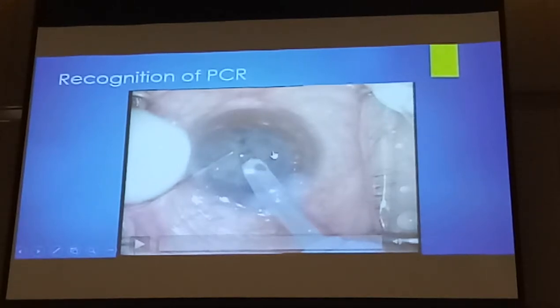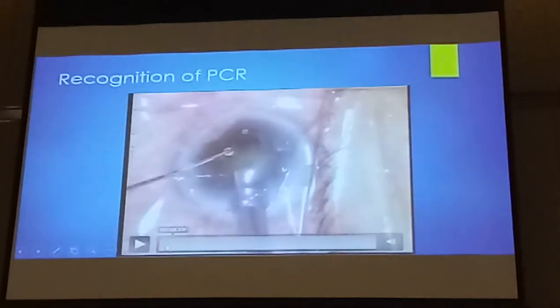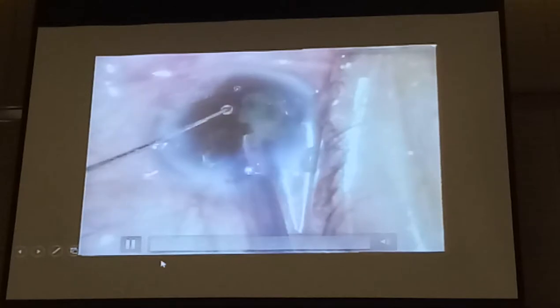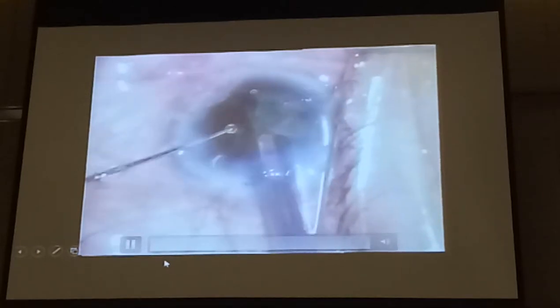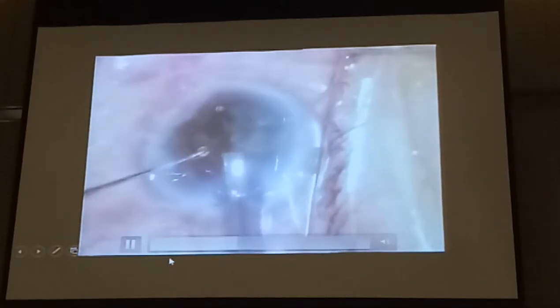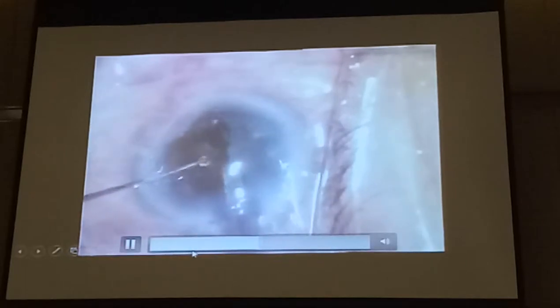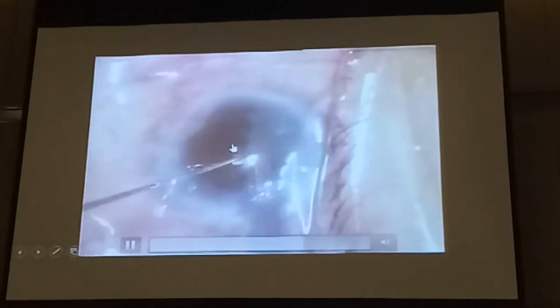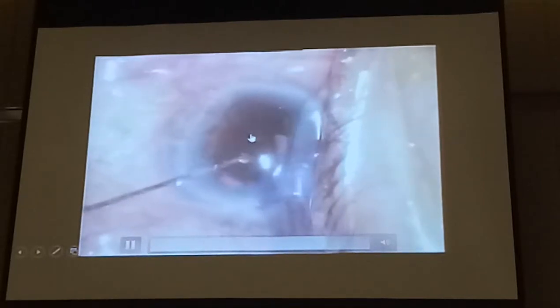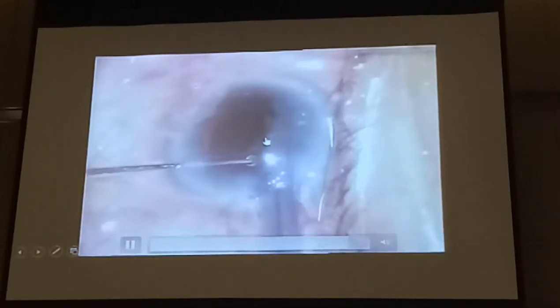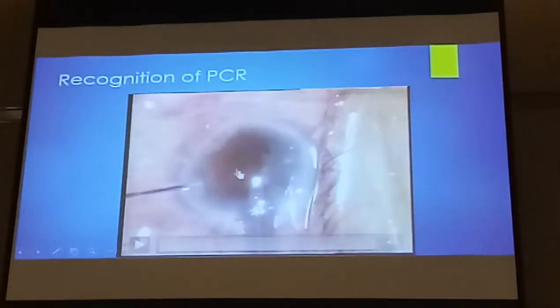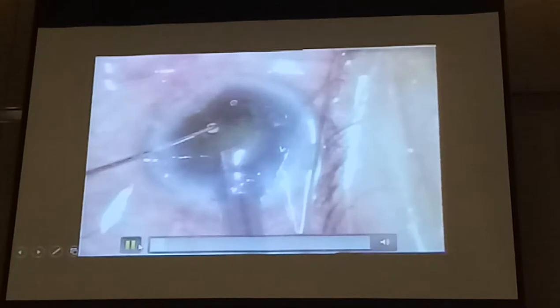Nothing has dropped through yet, but you need to recognize it early. Watch this one — this one is very scary. Something is happening on this side; things are like floating, not moving around normally. The nucleus has been caught and the surgeon knows that. He's trying to remove the nucleus. I'll show you again.